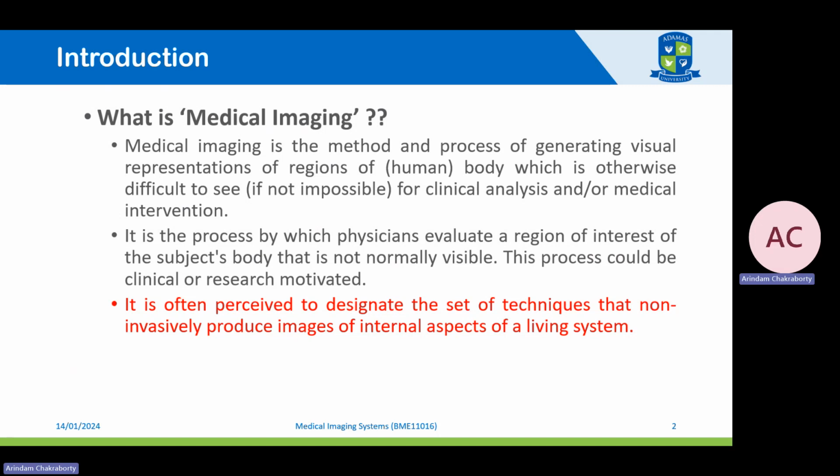The process is important for several reasons: for clinical interventions by physicians, for evaluating structural abnormalities or the functioning of any organs of the body, or it can be completely research motivated. One important point is that the majority of medical imaging is done non-invasively to produce internal images of a living system.